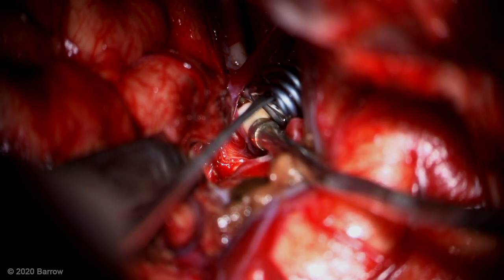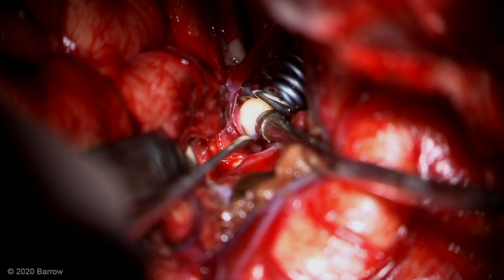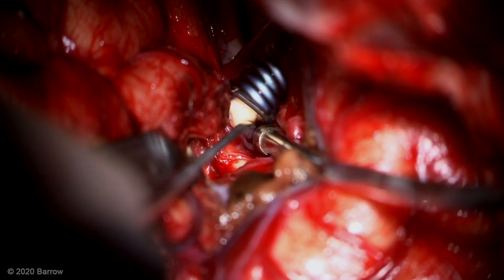Here now is a view more medially to that trunk of perforators on the medial side. Now the aneurysm is soft. This is ICG confirming patency of that recurrent artery of Hubner, as well as the deep perforators.